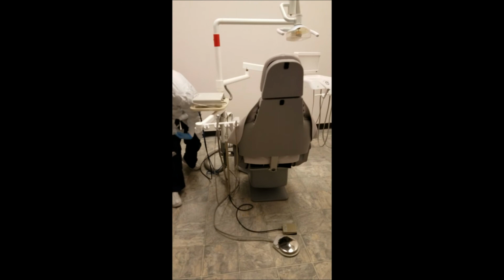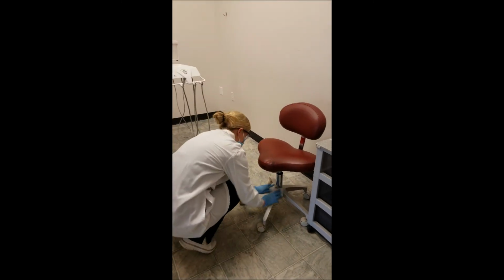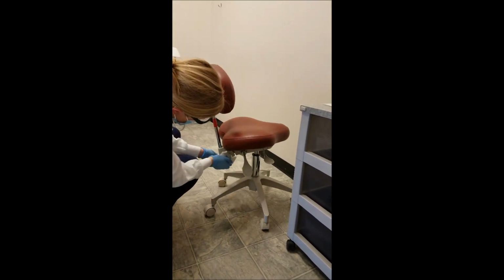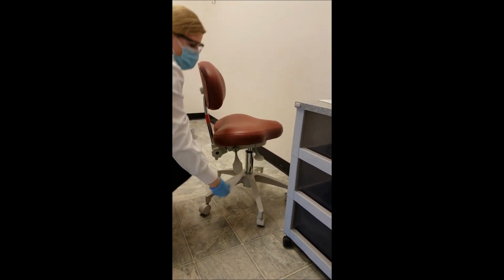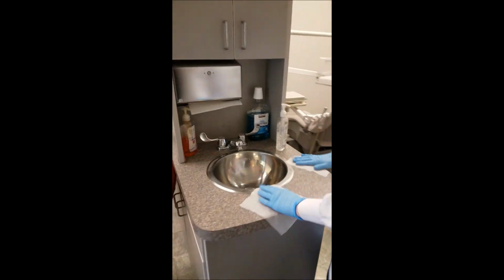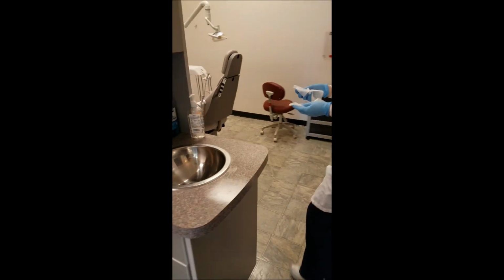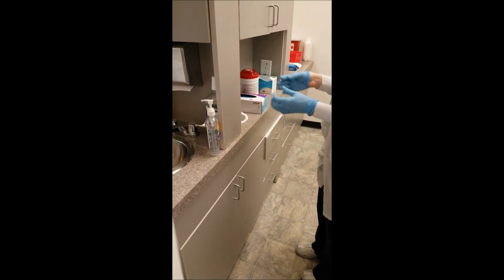And then the base of the operator chair, and the operator chair adjustment levers, and then she will do around the sink and inside of the sink. And then she will remove her gloves and use hand sanitizer or wash her hands immediately.